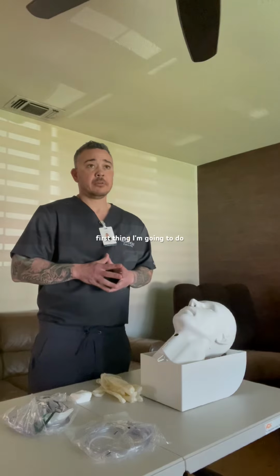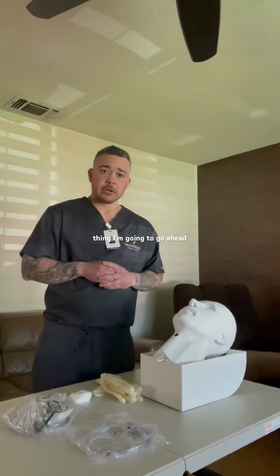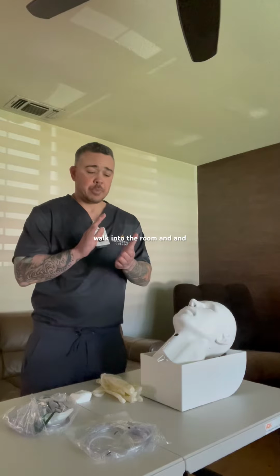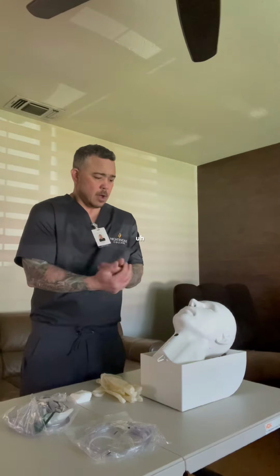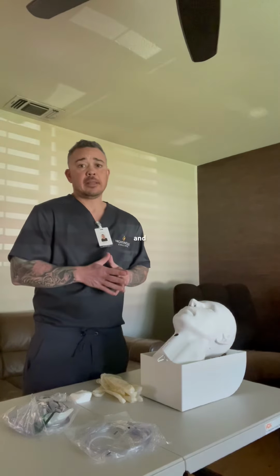Okay. First thing I'm gonna do is make sure when I walk into the room, the door is closed or the curtain is pulled to make sure there is patient privacy. Second thing I'm gonna go ahead and do is walk into the room and make sure I use proper hand hygiene.